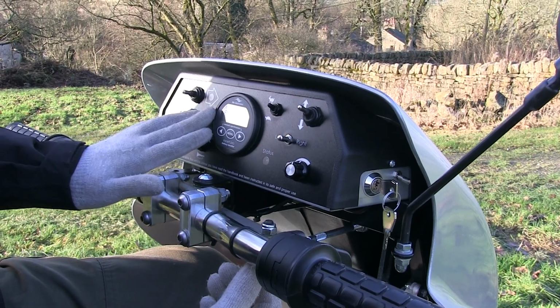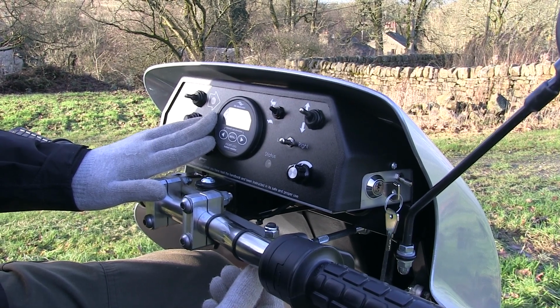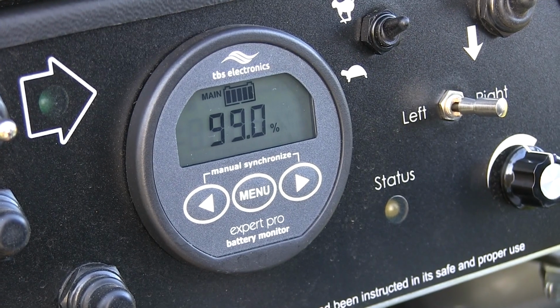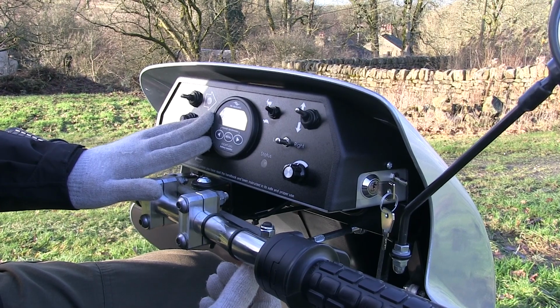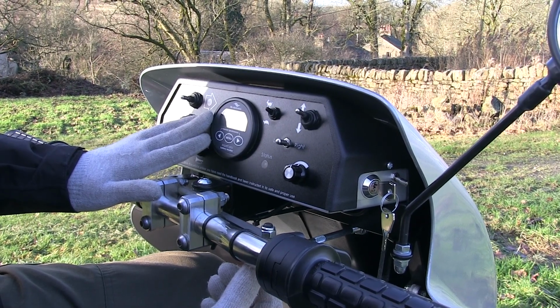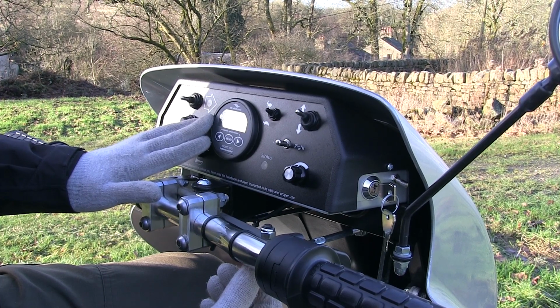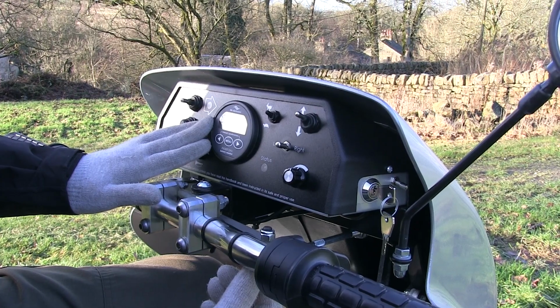The display in the centre is the battery level of the Tramper. On this Tramper at the moment it's showing 99%, and usually the Tramper would be fully charged when you receive it. If the Tramper is getting a lower charge, once it gets down to something like between 50% down to 20%, you'll need to inform the hire people that it needs to be recharged.